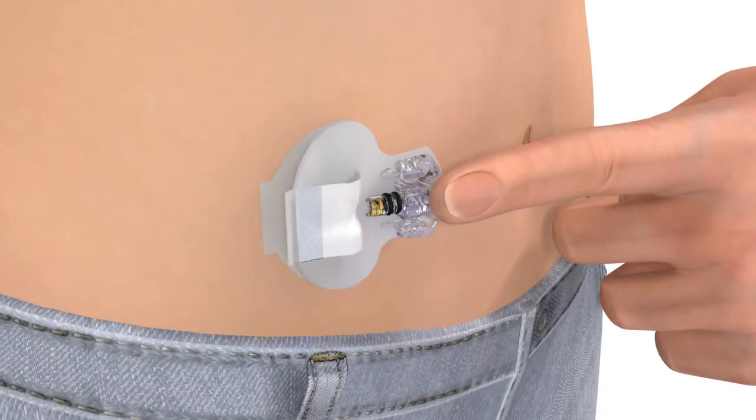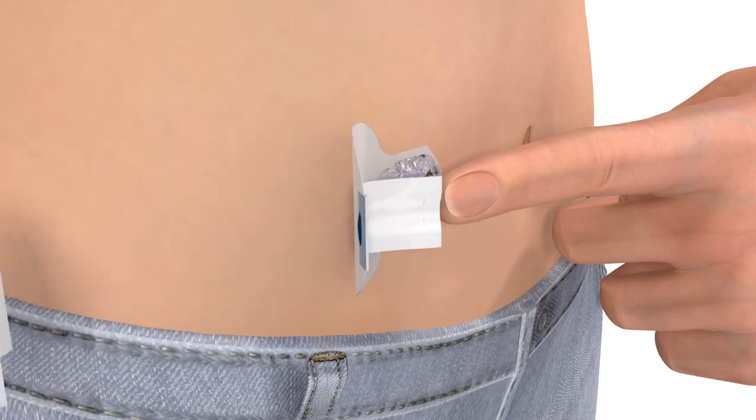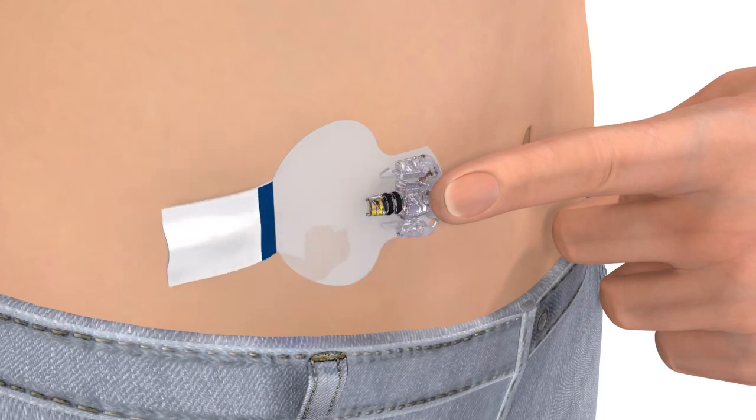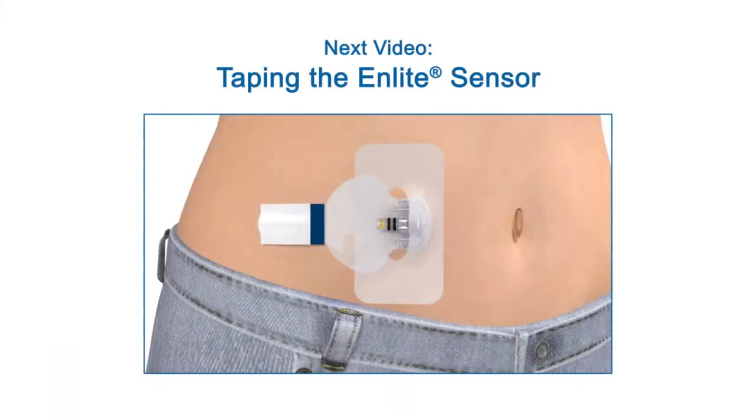Carefully remove the paper backing that is located underneath the curved adhesive pad. Press the adhesive against the skin. Now flip the adhesive tab so that it lies flat against the skin, but do not remove the paper backing just yet.